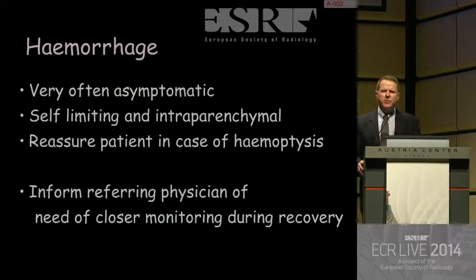Hemorrhage is very often non-symptomatic. It's self-limiting and intraparenchymal. The most important thing, you have to warn the patient that if he has hemoptysis during the biopsies or right after the biopsy, he shouldn't be worried too much. He starts saying, "Doctor, I feel something strange because this is the taste of the blood in the mouth. I feel something strange, I have to cough." And then you give him a gauze and you see the blood. So you have to reassure him. Most of the time it's self-limiting.